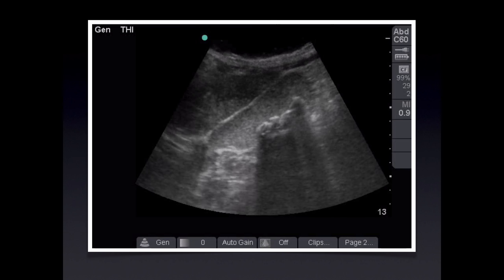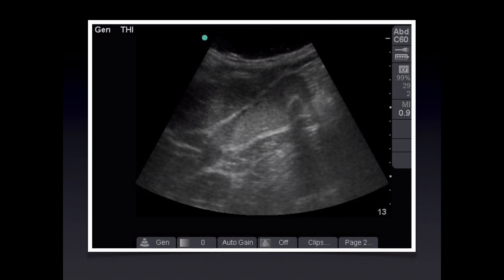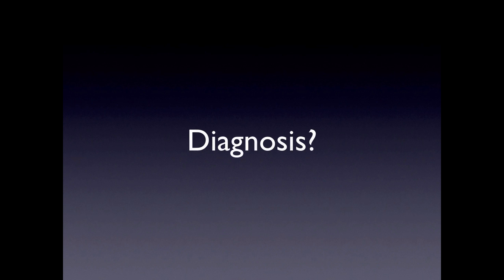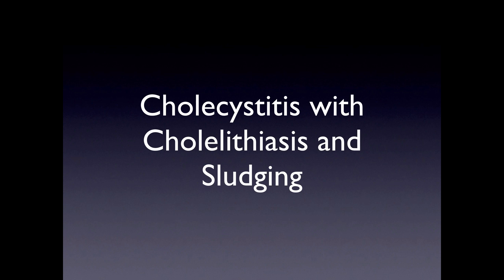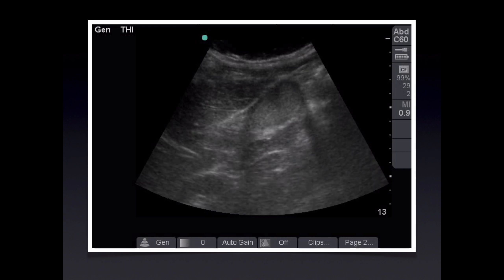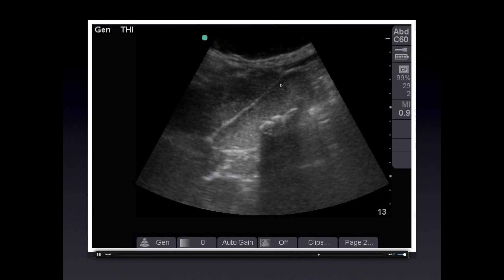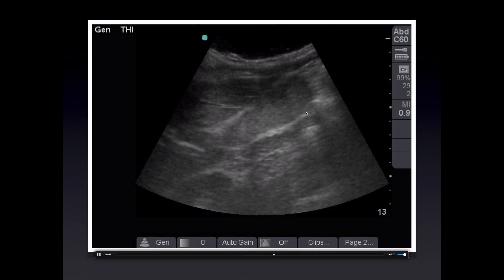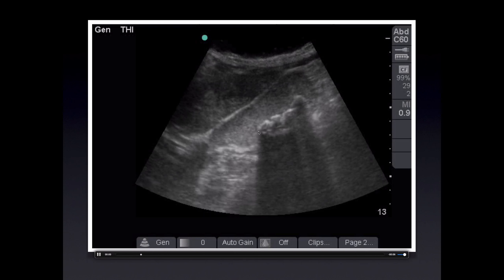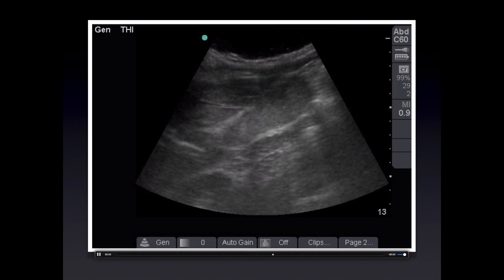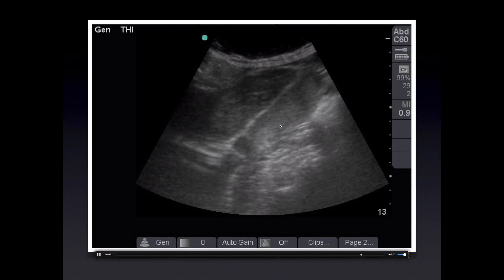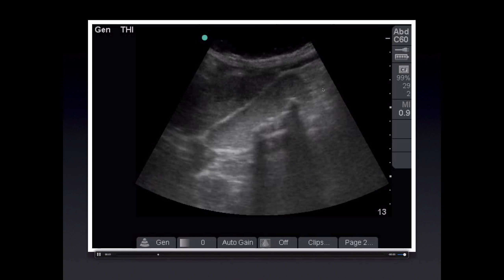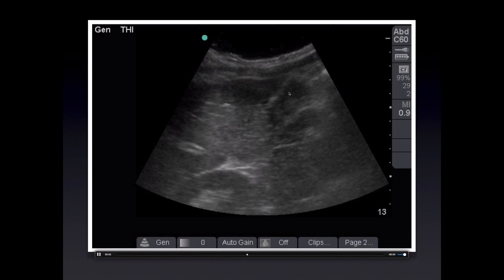Case 7: standard sagittal gallbladder sweep — cholecystitis with cholelithiasis and heavy sludging. Quick review of the pathology: here's the gallbladder wall anteriorly and posteriorly — the gallbladder is entirely sludge-filled and contains many bright white echogenic stones casting dark shadows. In the right clinical context, this is highly concerning for cholecystitis. The sludge looks nothing like a reverberation artifact, which would only be seen at the top of the screen.